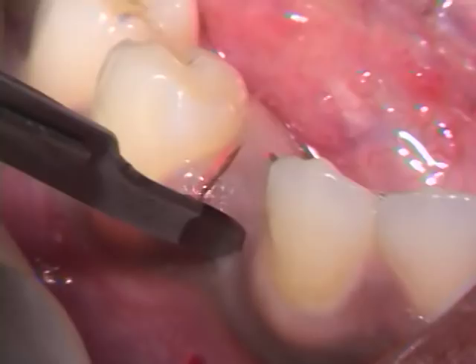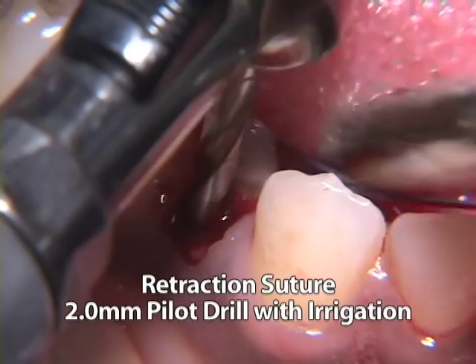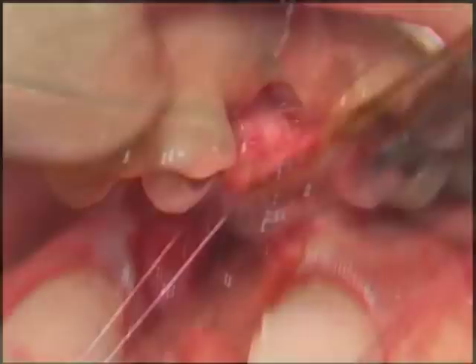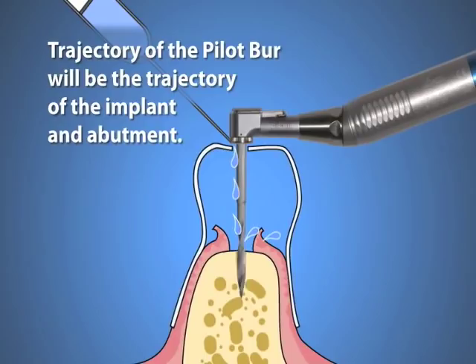Caution is advised when preparing an osteotomy using the semi-lunar flap, since visualization of the implant site is limited to only the crestal aspect of the bone. Therefore, inadvertent buccal or lingual fenestrations are more likely to occur. Simply stated, the pilot osteotomy, to the extent possible, should be positioned in the center of the edentulous space and with the same trajectory of the proposed tooth.